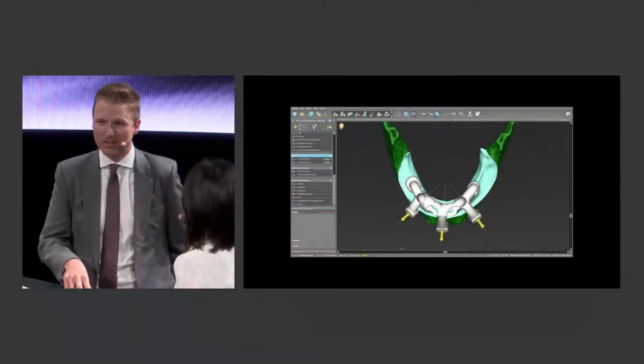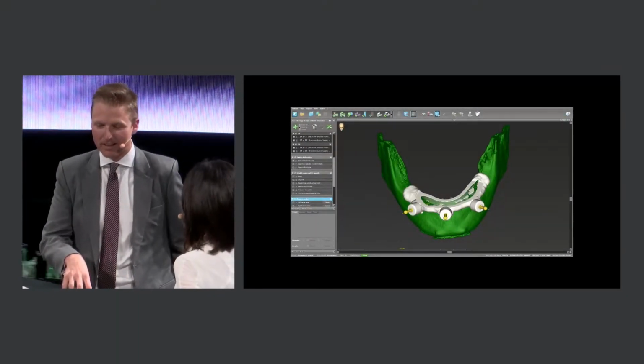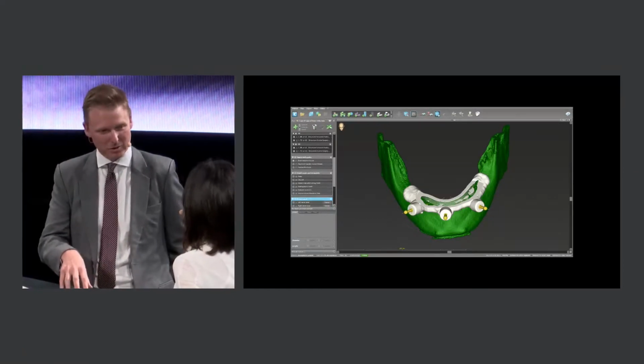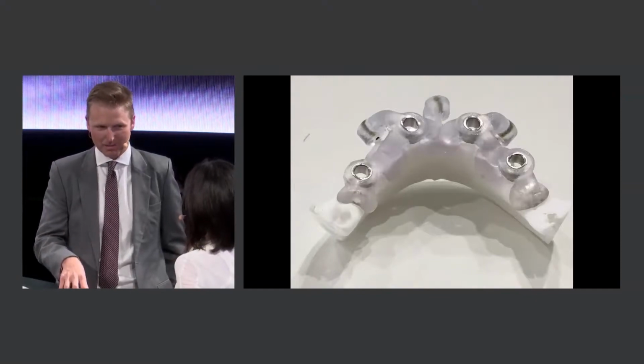Yeah, sure. So some of the more complex cases I'm encountering, whether a patient has had an overclosed dentition, difficult occlusions like a class 3 with no reliable contact points. We see a lot of elderly patients in my practice, just because that's the demographic that we see. So those elderly patients may have been edentulous for a number of years, and there's very limited tissue to work with. In all of those situations, again, getting back to what we were saying before, it's the bite record that's the hardest part. Yes.